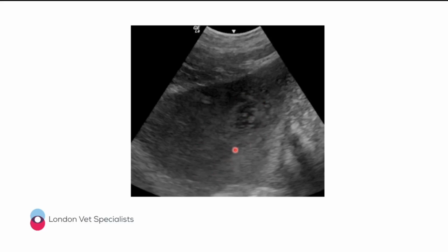So when this patient was breathing, we could see these particles swishing around in the abdomen. Now, just looking at the appearance of this effusion and those echogenic particles using ultrasound, we might say, I think this is more likely to be hemorrhage, or maybe more likely to be something proteinaceous like a modified transudate or an exudate. And this just turned out to be a transudate.